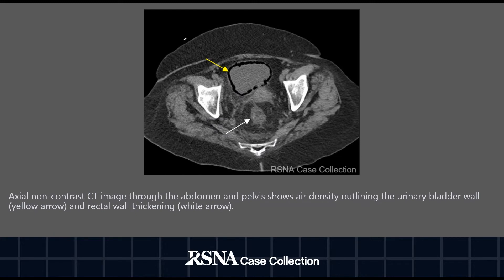This is an axial non-contrast CT image through the abdomen and pelvis showing air density outlining the urinary bladder wall (yellow arrow) and rectal wall thickening (white arrow).